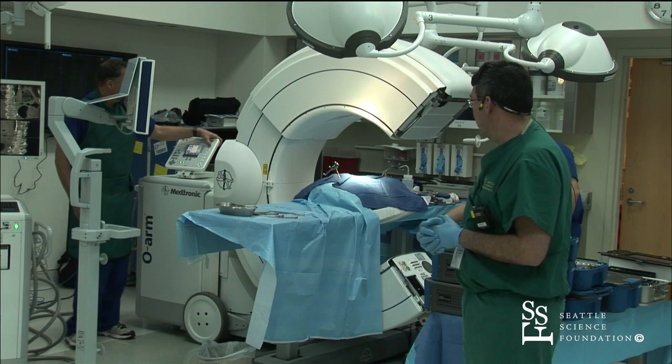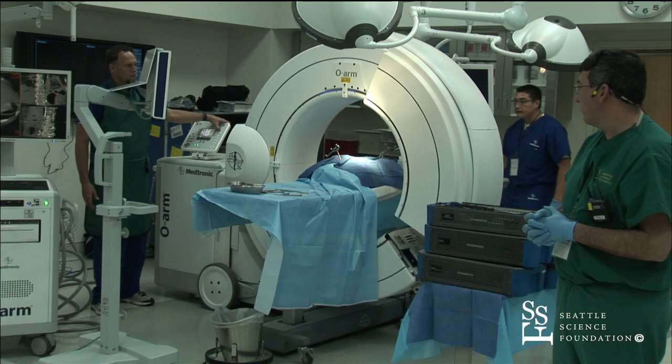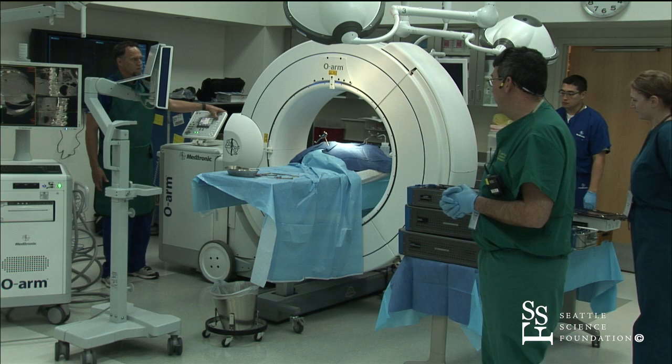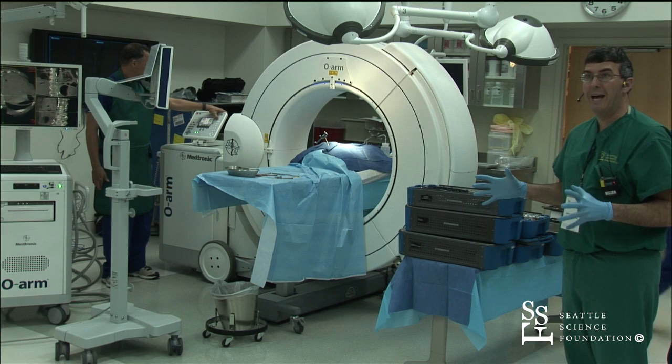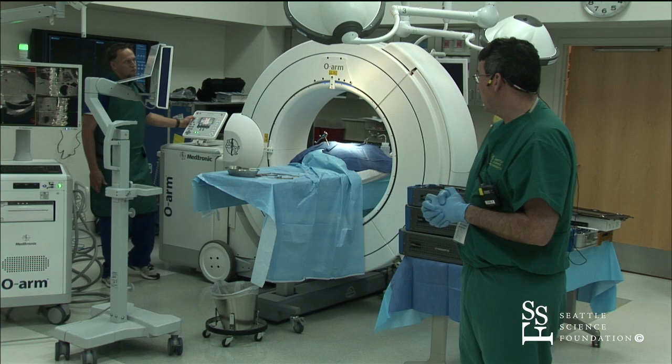So here we have our dissection all done. Now we usually take the system and drape it with real drapes, then we bring the O-arm in. We've done it many different ways with draping the system — it seems to be more user-friendly if you do it this way; you have less chance of hitting the spine. So the O-arm closes very nicely, it comes down. Once you get a team to do this, it takes about 20 minutes to do the whole spin. The first couple of times, it took a couple hours because invariably you did something wrong. So here we go — you do AP and lateral to make sure you're over the right area. In this case we decided to do a pelvic screw, so we did O-arms of the pelvis. We just completed that — that was the world's fastest spin.